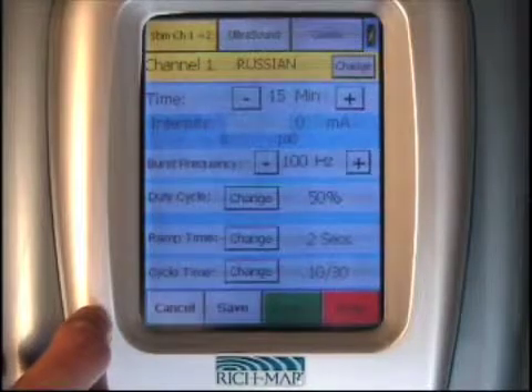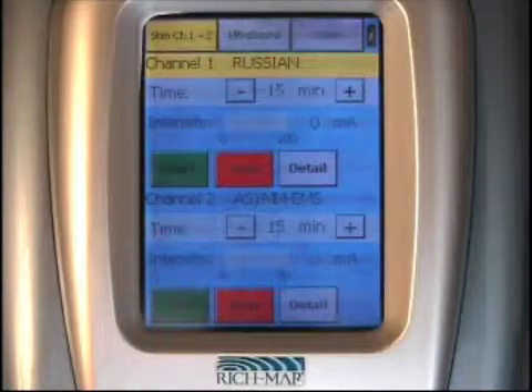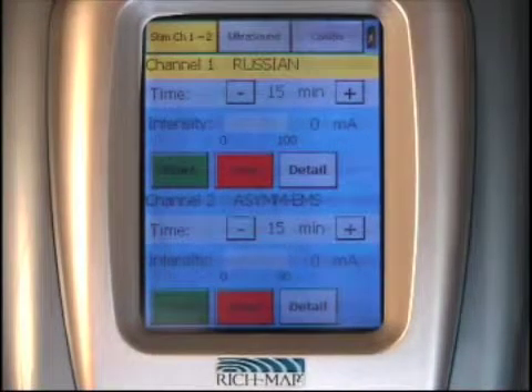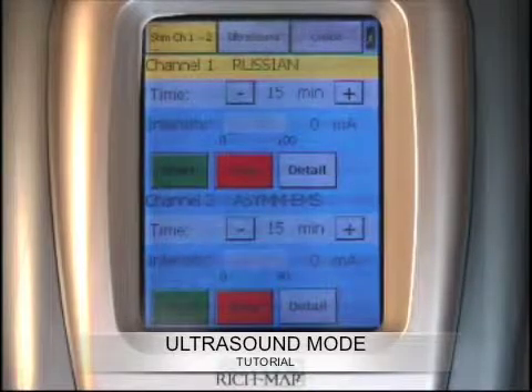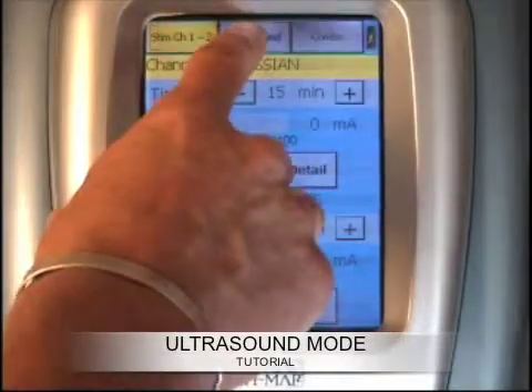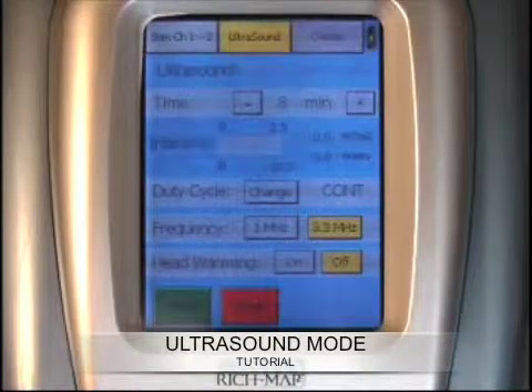At any time you want to go back to the main menu, you simply press the top tab and you will revert back to the main menu. The Sonic Stem ultrasound feature is the second choice on the top tab menu. You simply press the top tab for ultrasound, which will illuminate, and the ultrasound is ready to set up.